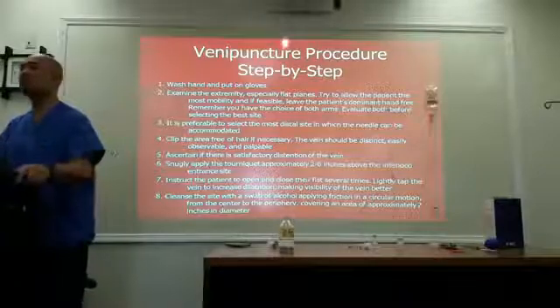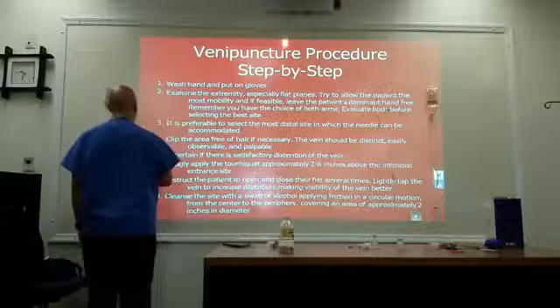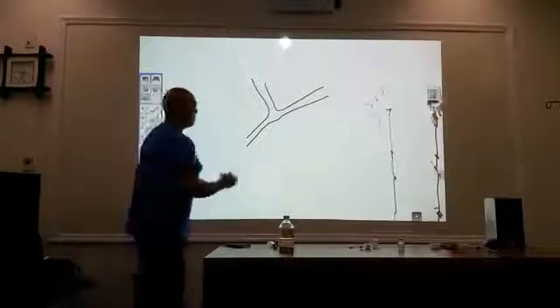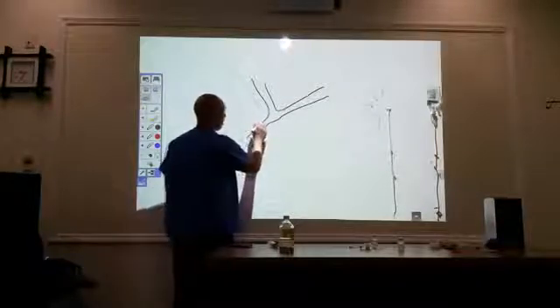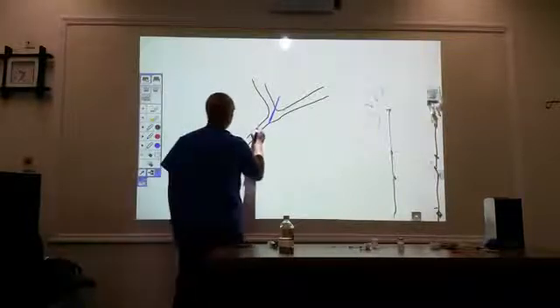Number 3, it is preferable to select the most distal site in which the needle can be accommodated. What that means is the most distal part of the arm or the vessel that the needle can accommodate. Here there's a vessel. If I'm going to go in with a needle, I am going to take the path that is most direct. I'm not going to go this way because if the needle's too long, I'm going to go through it and puncture the vein. So you want to go to the most distal part of the vein in which the needle can be accommodated. That's what it means.